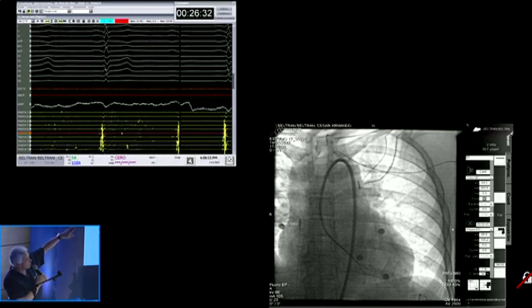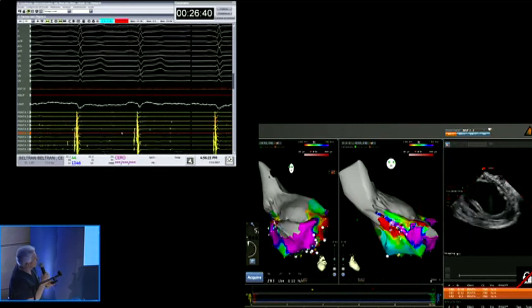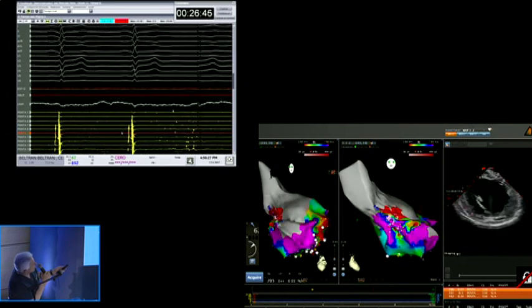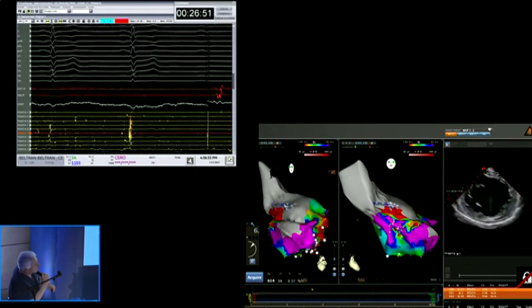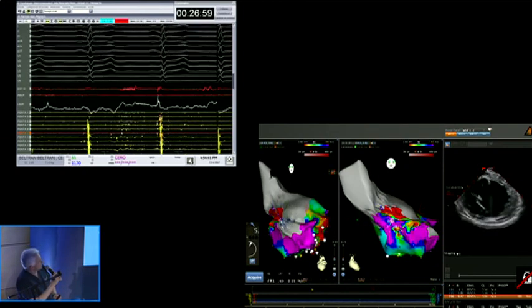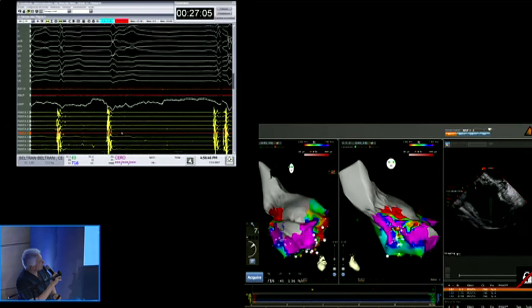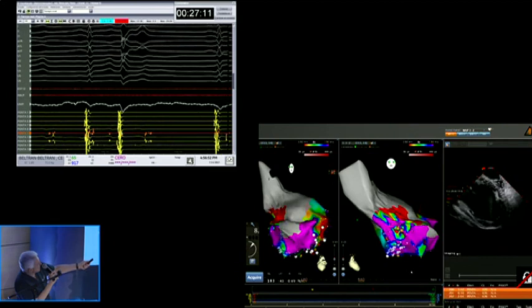So you see much more information, and the quality is significantly better. Coming back. Okay. So those are all. Andrea, are you using Penta for every case? I mean, VT, scar modulation or VT? Usually VT, scar VT we are, yes. Unless we're using stereotaxis, then sometimes we don't, but otherwise we use it for scar VT all the time. It just gives you a fast recording that you get.